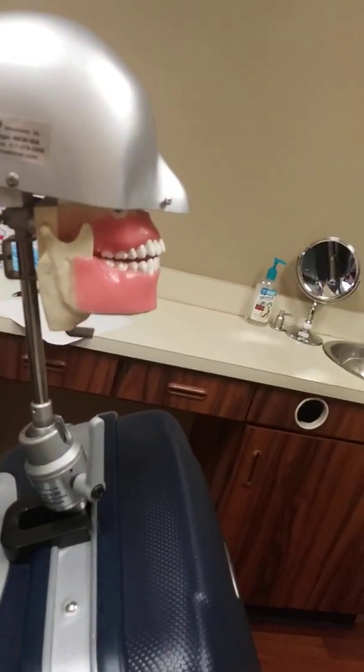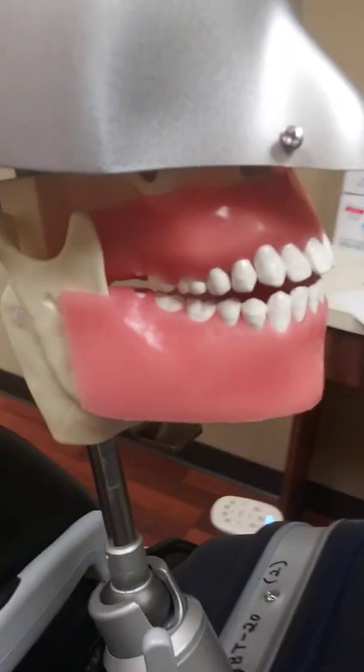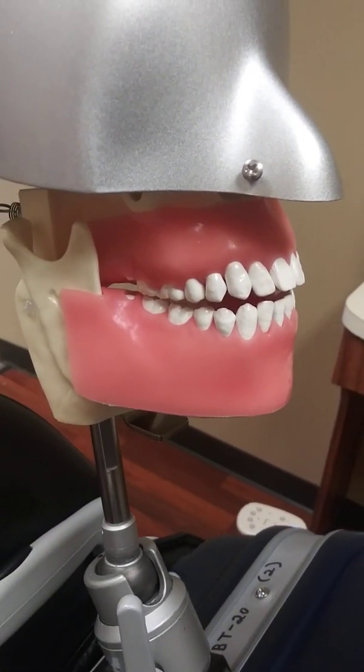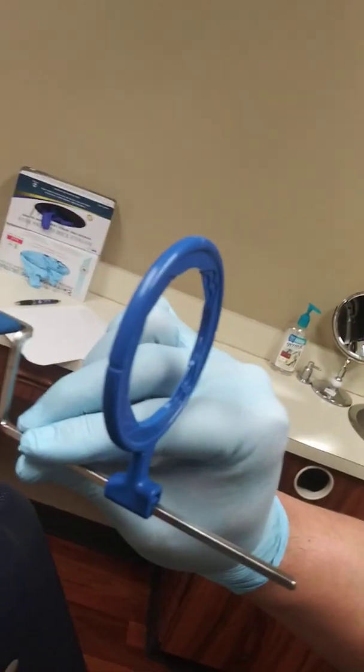So let's say that a patient came in and we needed to take a PA of tooth number seven. It's an anterior tooth. We need a film holding device — we can't just put a film in there and hope that it stays. We have to have something to hold it. So this is when our film holding device comes into play.